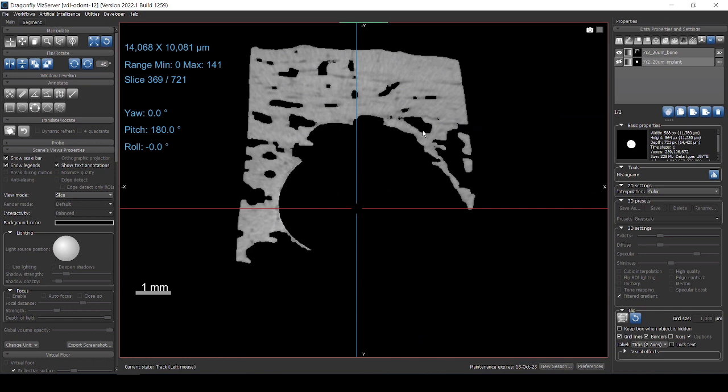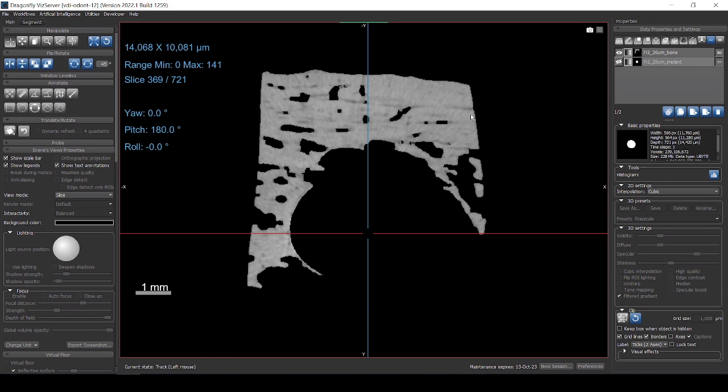I'm going to start from here and you can see clearly that it's not really very detailed. So this scan was taken at 20 micrometers pixel size, so I couldn't really segment properly the pores in the bone, but that's not really important for the case here. What we want to do is to get the amount of bone that is in contact or very close to the implant.